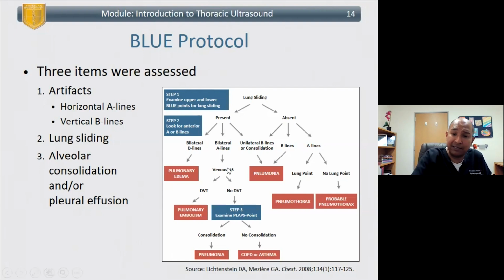And of course, in this lecture, we'll also talk about pulmonary embolism. And truth be told, I'll say it 1,000 times, you cannot diagnose a pulmonary embolism based upon an echo. There are findings that may suggest it could be a PE, but one thing you can do is rule out a deep vein thrombosis in your legs. And it's not as tricky as you think it is. So that's why when someone's short of breath, if you diagnose a DVT in the acute setting and they say, hey, I have pleuritic chest pain, maybe they have a PE. In the acute setting, it pretty much wouldn't change your management that much.